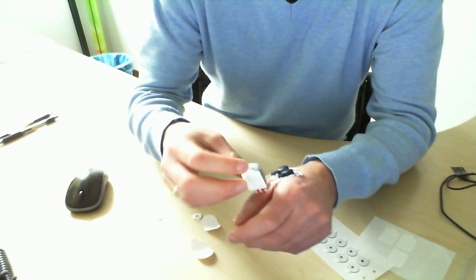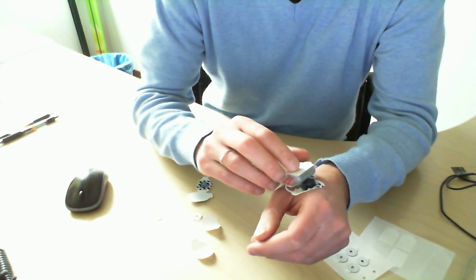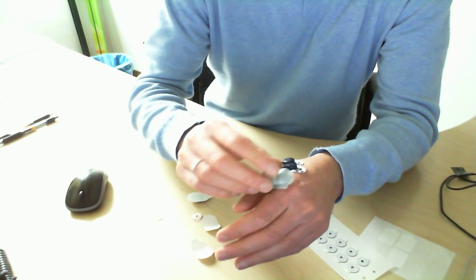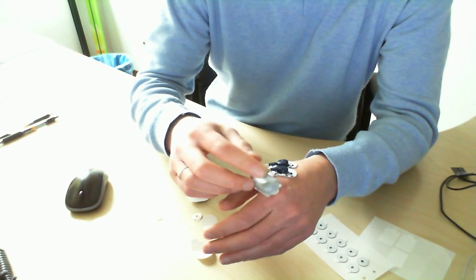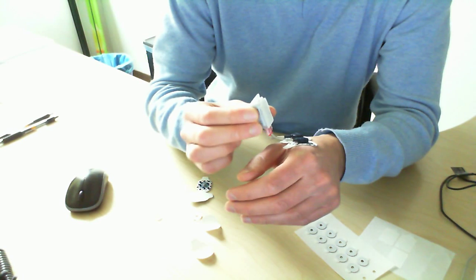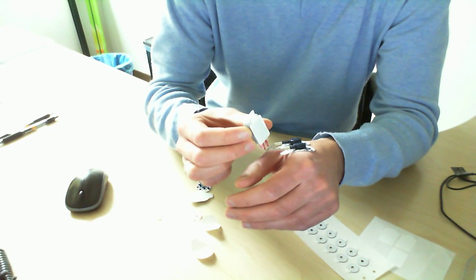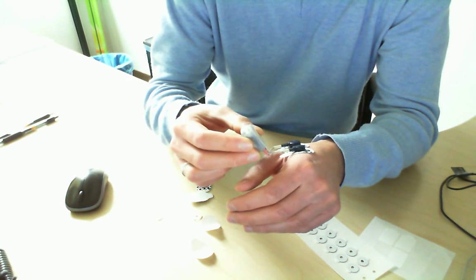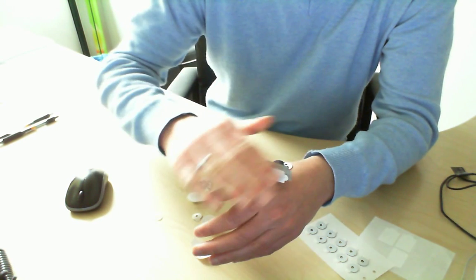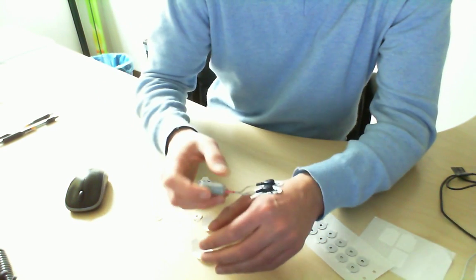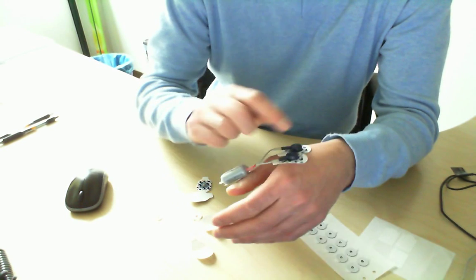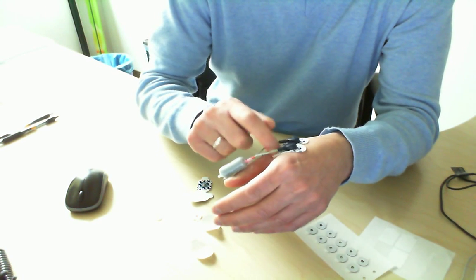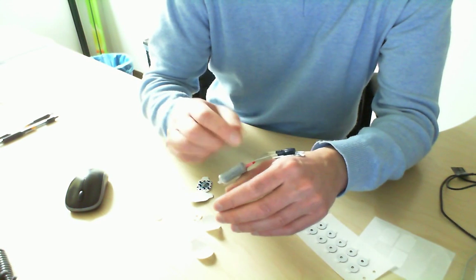Then you can remove the sticker from here and put it next to the muscles. Sometimes this will come off in the water acquisition, so you might want to put some additional tape on it. But the electrodes, if they're sticky enough, won't come off.